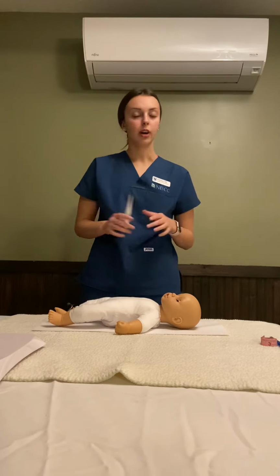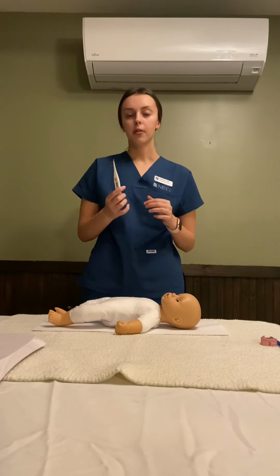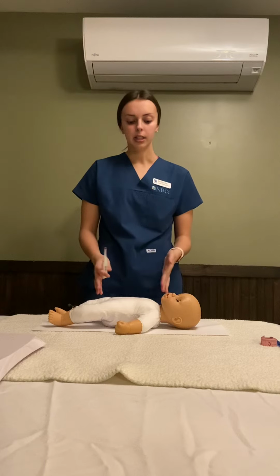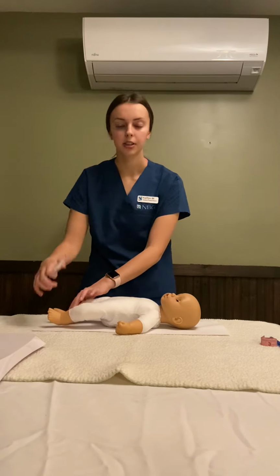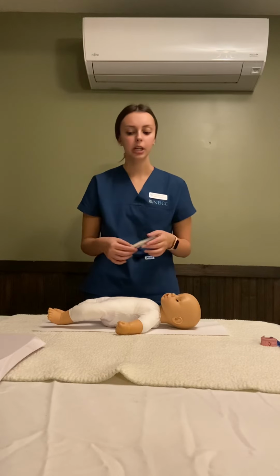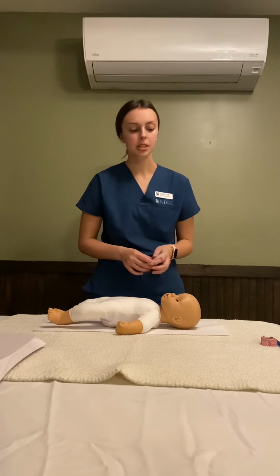And you can also do a rectal temperature, which you would put petroleum jelly on the silver tip of the thermometer, and you make sure the baby is lying on their back, and you would put their legs up, and you would insert the thermometer 2.5 centimeters, and you would hold that for 1 minute until the thermometer beeps.